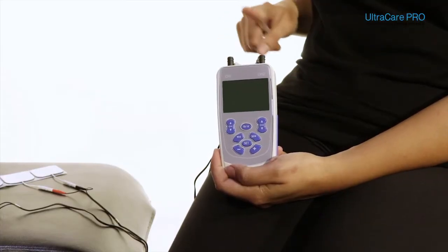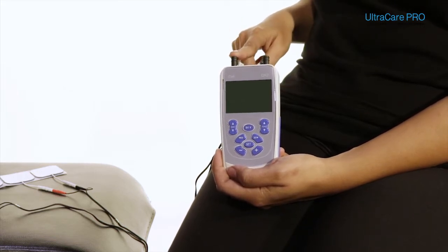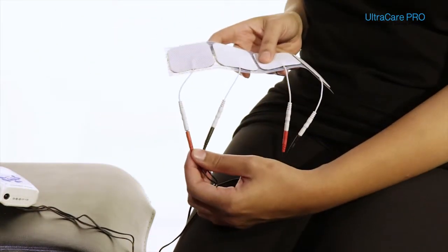The wires attached to the electrodes come from channel 1 and channel 2 in the device. Each channel supplies current to two electrodes, one of red color and another of black color.